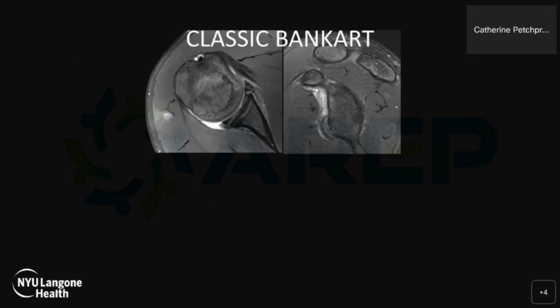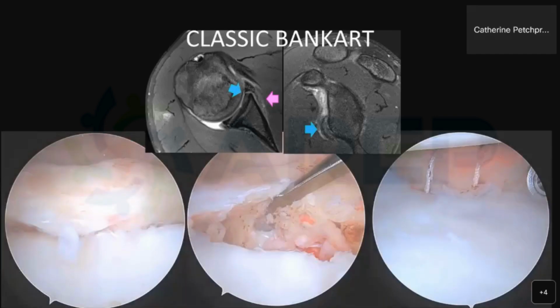Here again is the appearance of the classic Bankart lesion on the axial image and sagittal oblique image. The anteroinferior labrum is detached and anteriorly displaced from the glenoid rim. The scapular periosteum is disrupted. At arthroscopy, the torn labrum is easily lifted away from the glenoid rim by the probe. Soft tissue Bankart lesions such as this can be treated with soft tissue Bankart repairs, seen here in the last image with sutures securing the labrum to the glenoid rim.